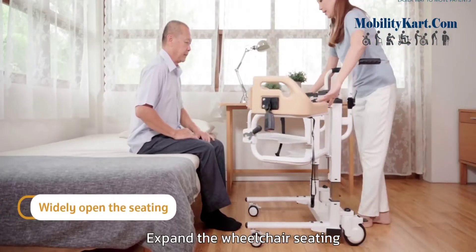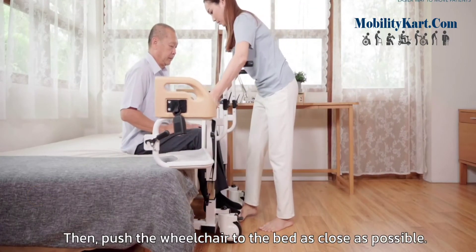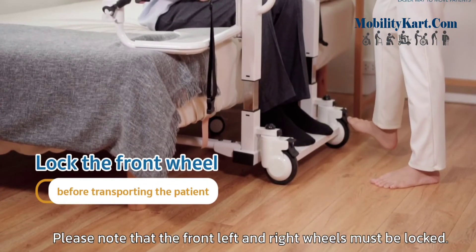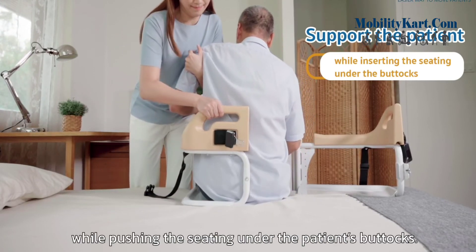Expand the wheelchair seating and move the patient's feet onto the foot plates. Then push the wheelchair to the bed as close as possible. Please note that the front left and right wheels must be locked. Then support the patient while pushing the seating under the patient's buttocks.